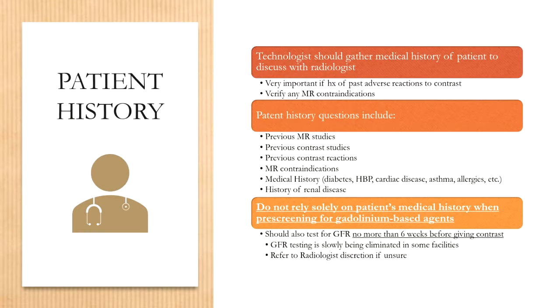The patient's medical history is something that we need to take anyway, just because we are medical professionals, and also to indicate any kind of MRI contraindications that may inhibit the patient from having an MR exam in the first place. We also need to make sure that when we're taking our patient history, we are talking to them about any past contrast reactions they may have experienced. And this may be with MR-based contrast or even X-ray or CT contrast. Any type of reaction should be noted in their file.